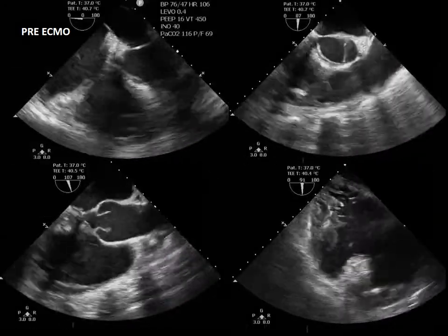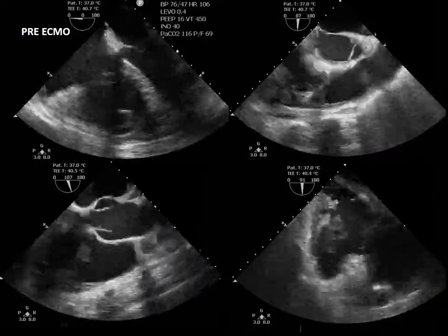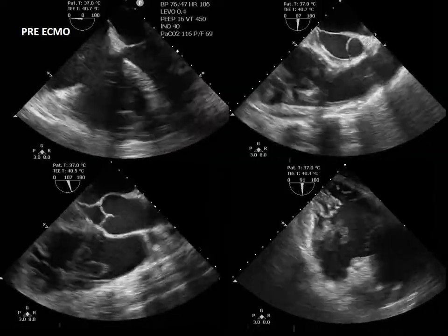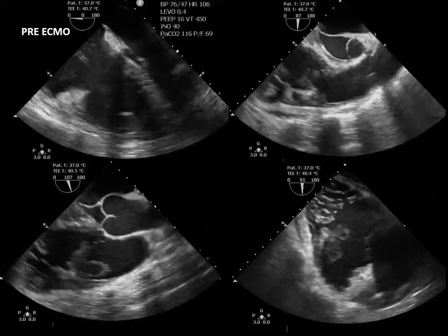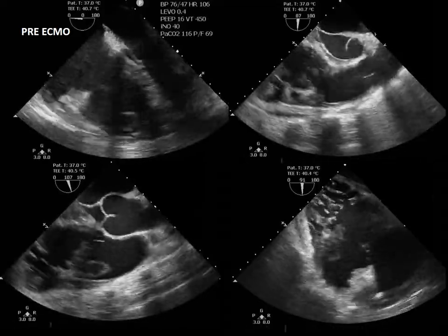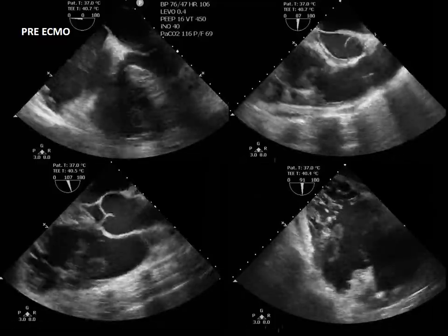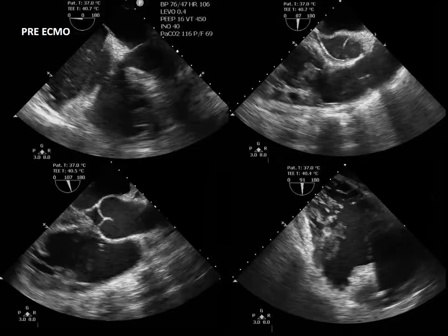This was another patient, also COVID ARDS, who was referred to us for ECMO, and as you can see also has some masses in his right ventricle which were clots. It's extremely important in those cases to make sure that the wires do not go into the right ventricle during cannulation, and I'll show you some examples of that a bit later.